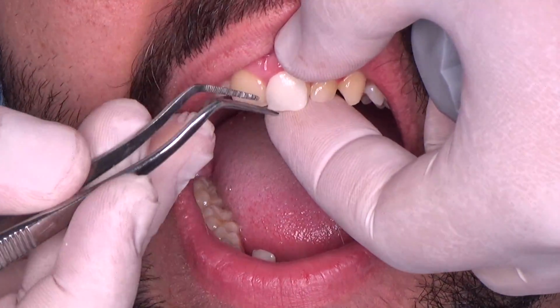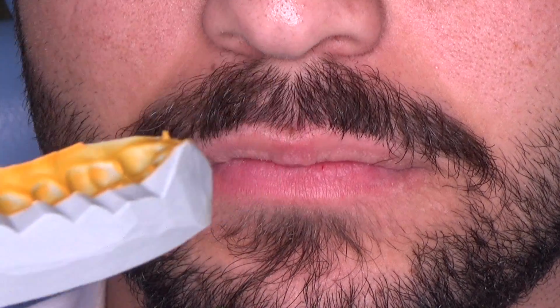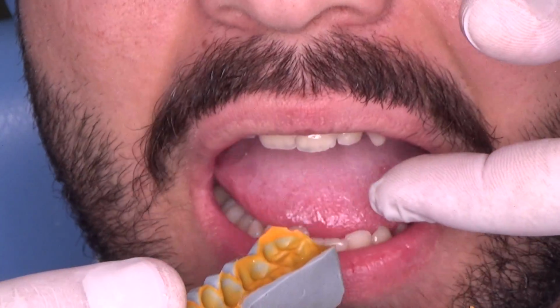But this silicone model will be well fit because the software made the final mock-up regarding this one, so it will fit with the composite in the mouth. Yes, it will fit with the composite because this is the thickness that we ordered. That's why you did the try-in with this mock-up in the mouth and then you remove it. Yes, I should remove it, and after that I will fill up all this with the bisacrylic composite.